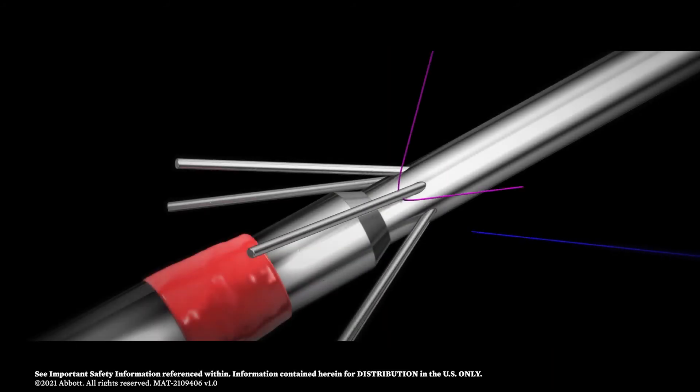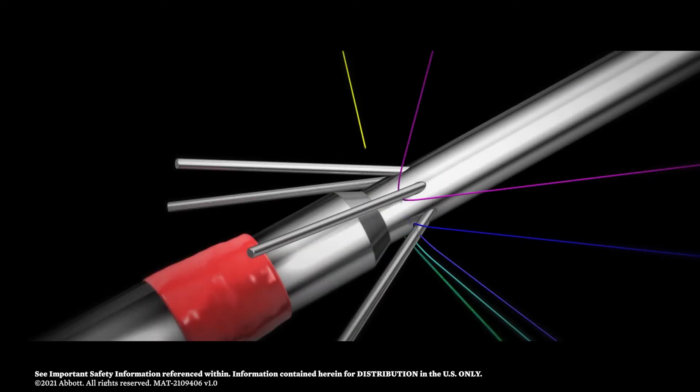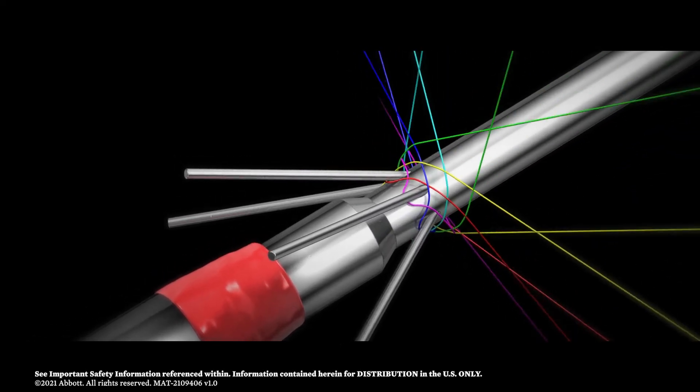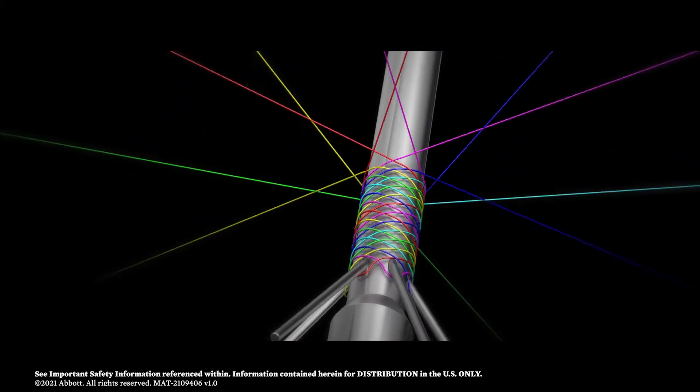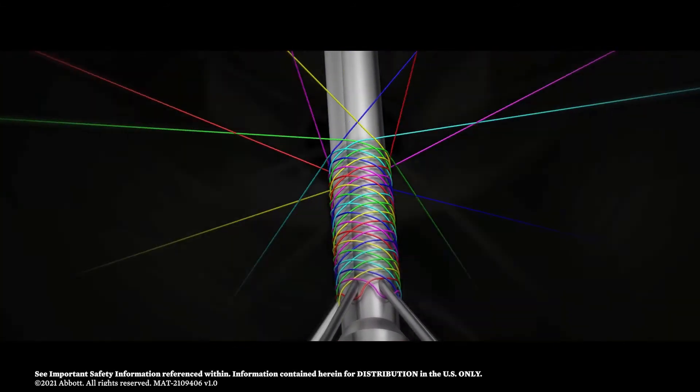One single nitinol wire is looped at one end of the stent, and this is repeated with each of the six wires. The wires are then precisely braided together to construct the Supera interwoven stent, as shown here.